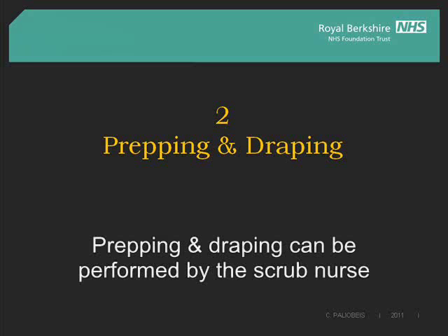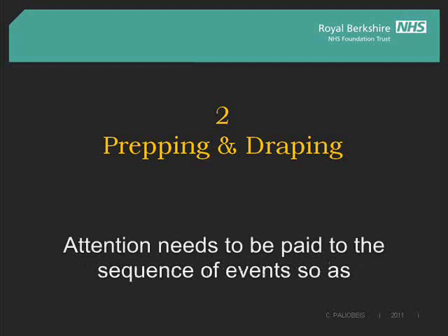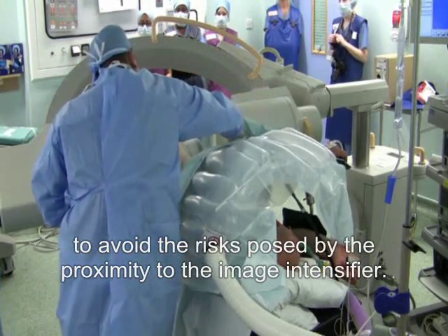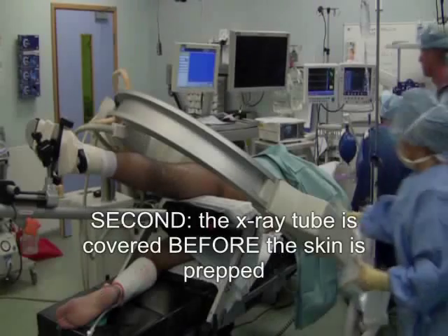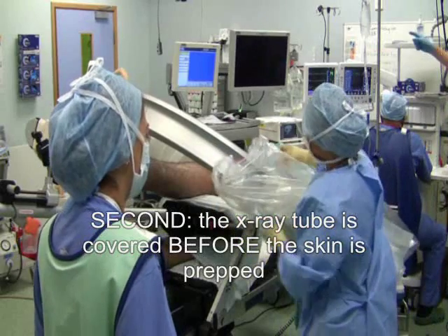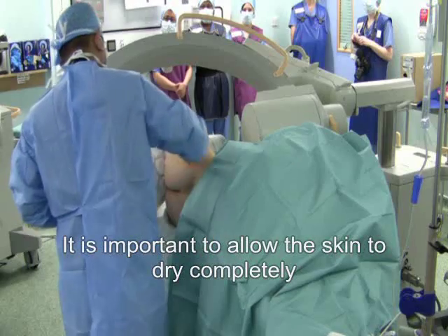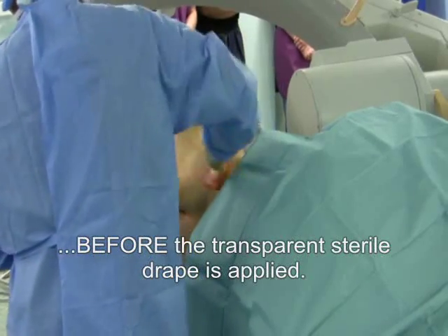Prepping and draping can be performed by the scrub nurse while the surgeon is scrubbing. Attention needs to be paid to the sequence of events so as to avoid the risks posed by the proximity to the image intensifier. First, a proximal sterile drape is applied. Second, the x-ray tube is covered before the skin is prepped — not after the skin is prepped. It is important to allow the skin to dry completely before the transparent sterile drape is applied.